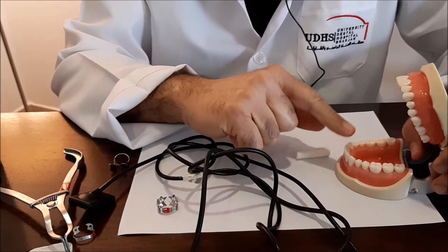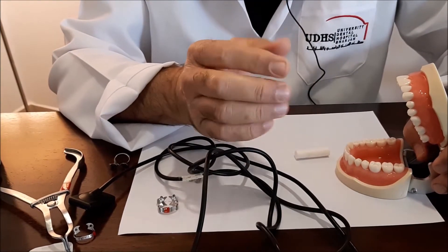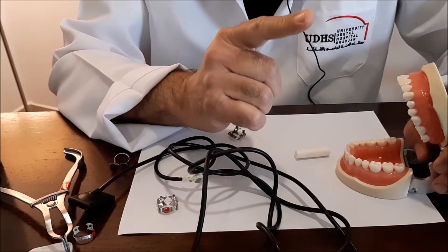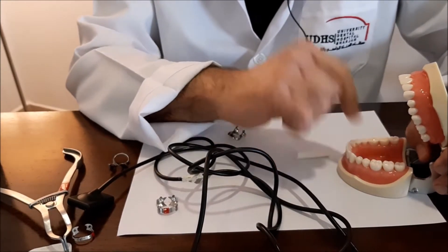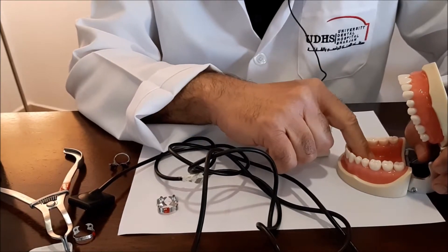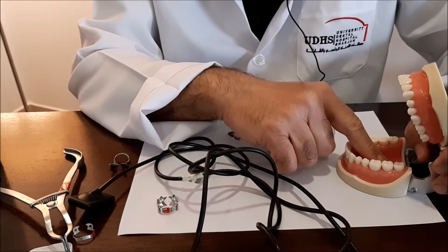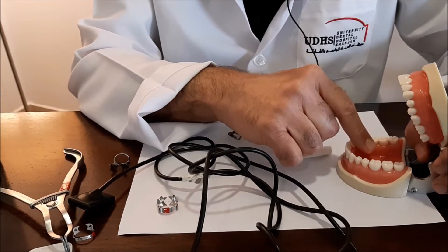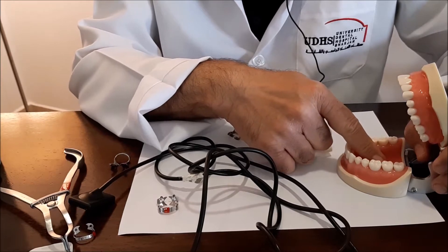In this video we are going to discuss the lower teeth. In principle they are the same, but there is a special thing about the lower teeth: the presence of the floor of the mouth. In some patients it is not easy to extend the sensor all the way down to capture the apex of the tooth.